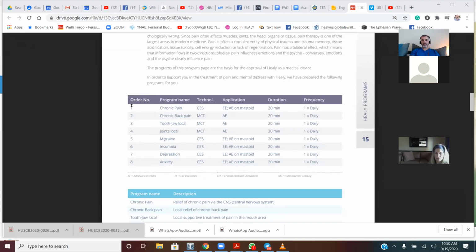So I can look at these 1, 2, 3, 4, 5, 6, 7, 8, okay? And if I went through number 8, and if on my phone itself, I'm confused as to which programs are which, I can pretty much guess what number 8 is going to be: anxiety. And best way to use it on the mastoid bones or with ear clips, right? So again, migraines on the mastoid bones or with ear clips, insomnia, depression, all these different things, right? So that's an insight for you there.